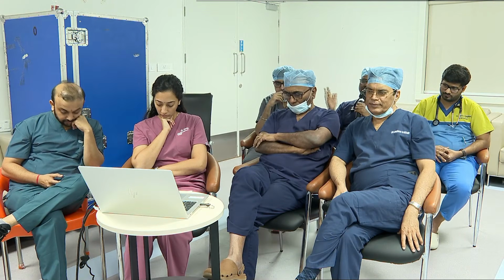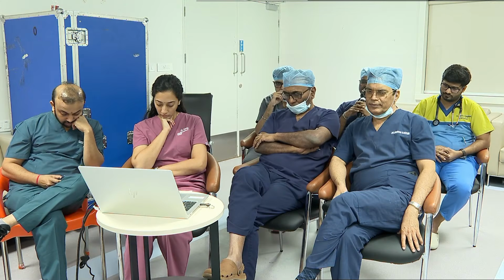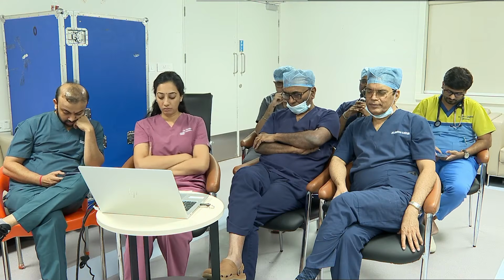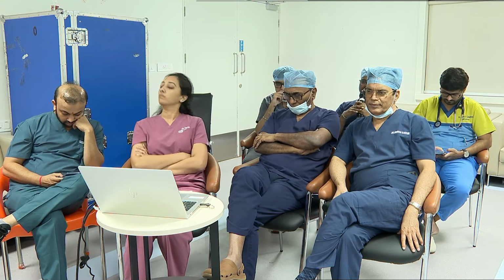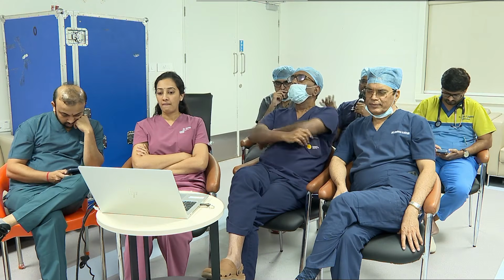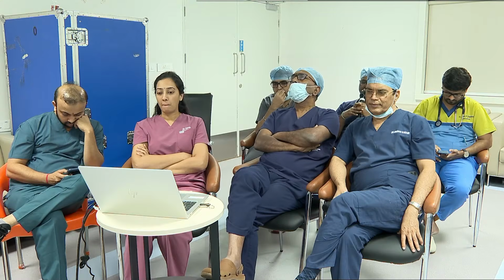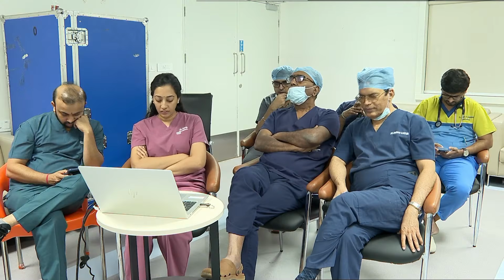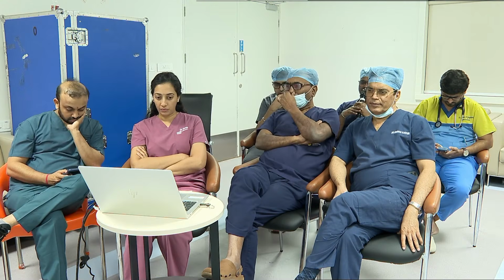Suppose you start your TAVR program after 65 years, then initially you can start with the annulus type of valves, and after 10 years, if there is any necessity, you can repeat with another supra-annular type of valves. Like that, up to 3 procedures you can safely deploy, and then we can achieve the target lifespan for these patients.